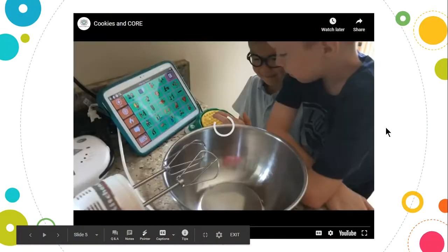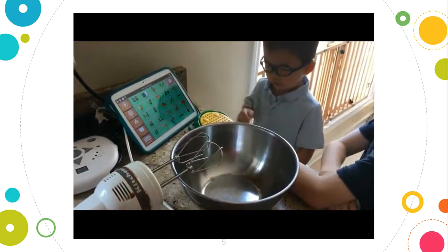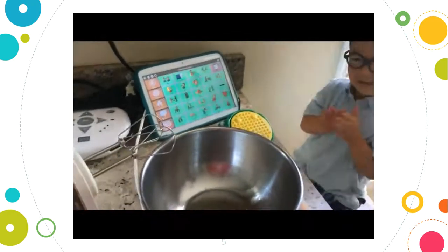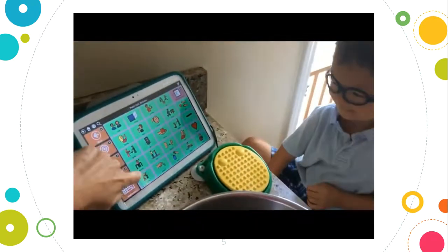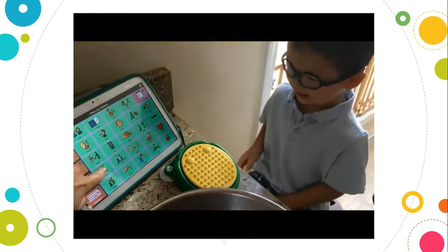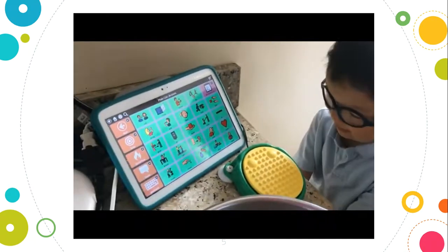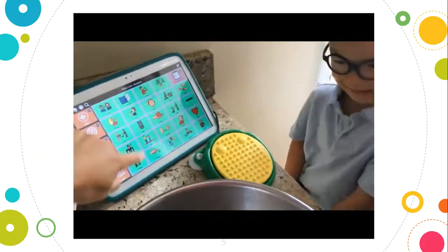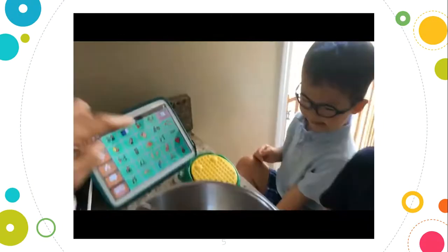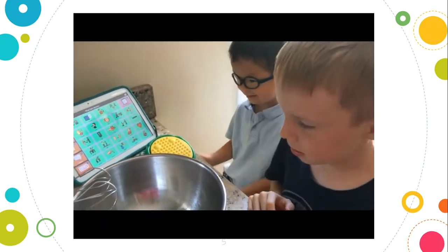You make it go? No. Make it go. Yay! Good job, Philip. Do you know what we're going to make? What are we going to make? Do you know? No. You don't know? No. That's okay. I'll tell you. We're going to make cookies. Cookies. Do you love cookies? Russell, do you love cookies?